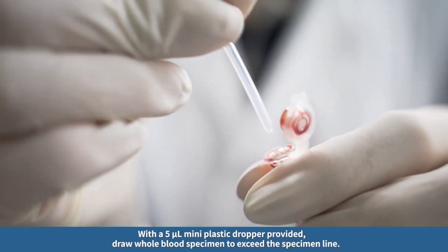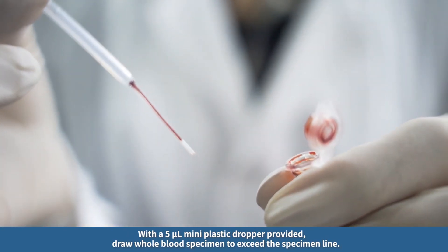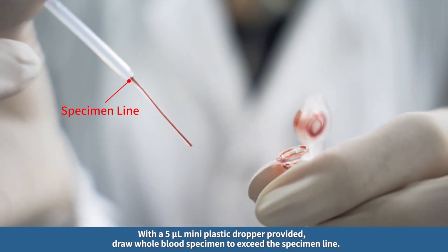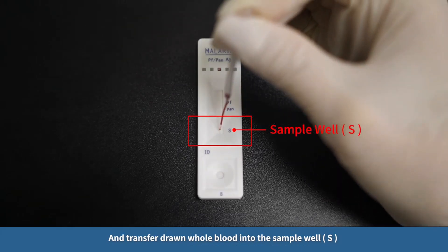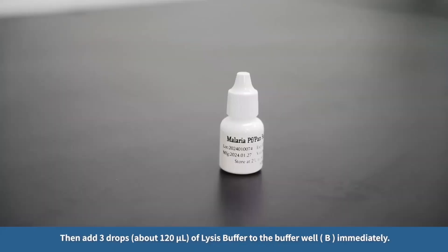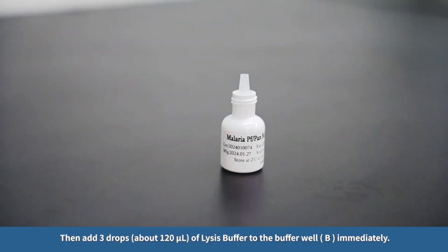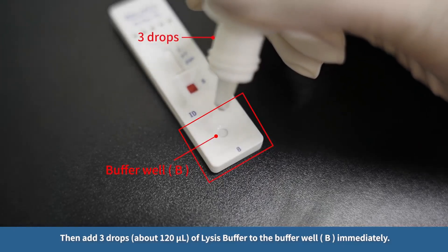With a 5 µL mini plastic dropper provided, draw whole blood specimen to exceed the specimen line, and transfer the drawn whole blood into the sample well (S). Then add three drops, about 120 µL, of lysis buffer to the buffer well (B) immediately.